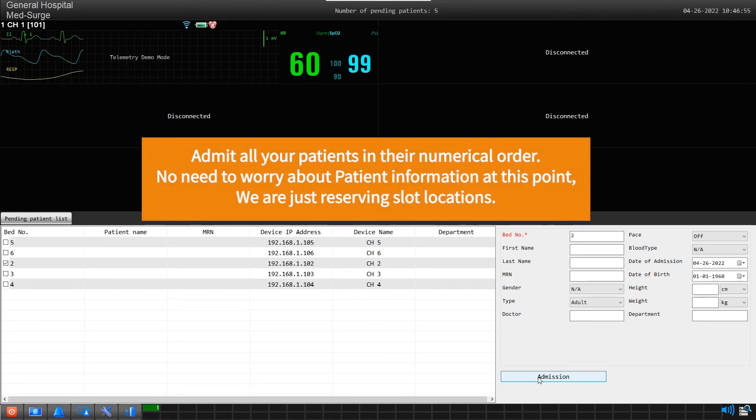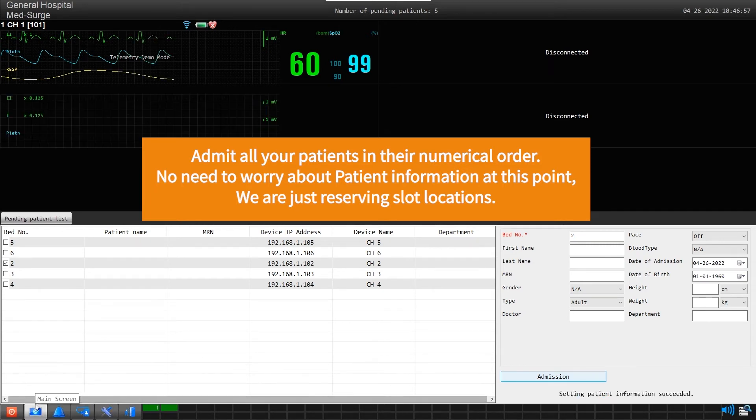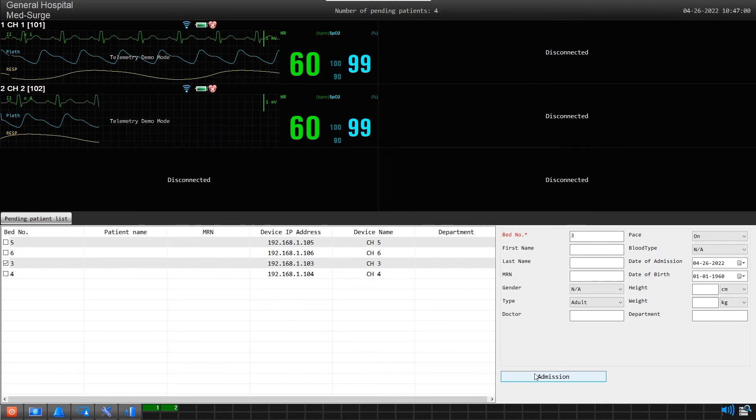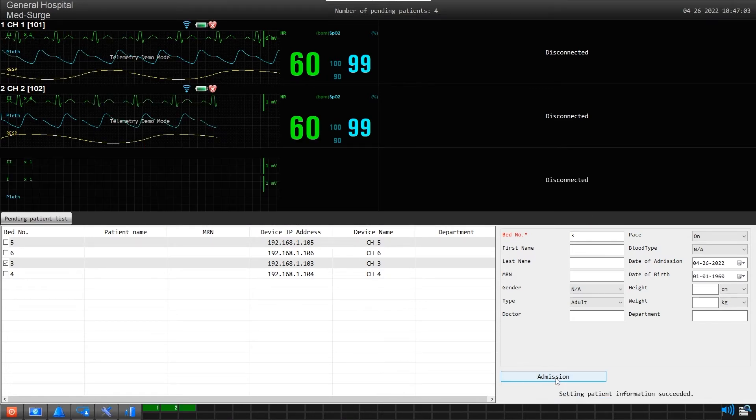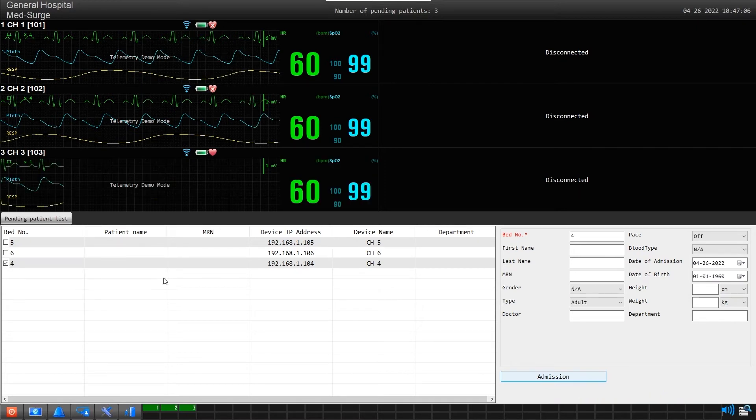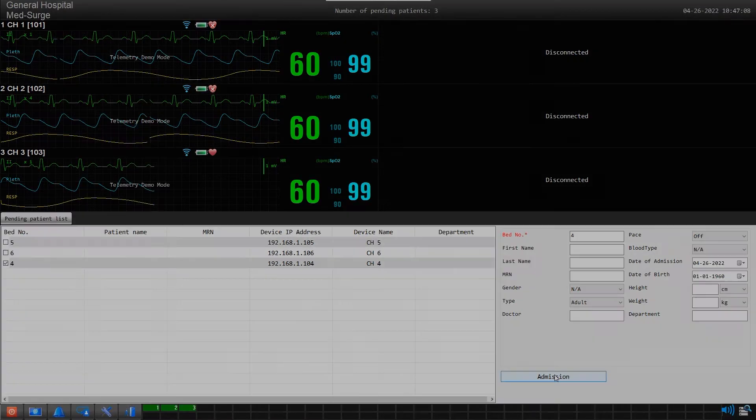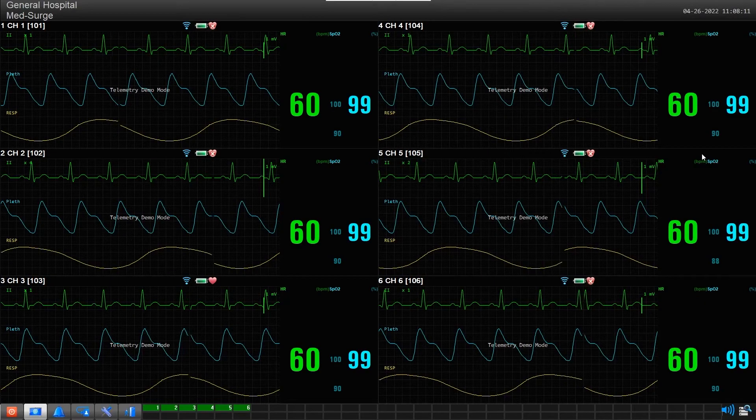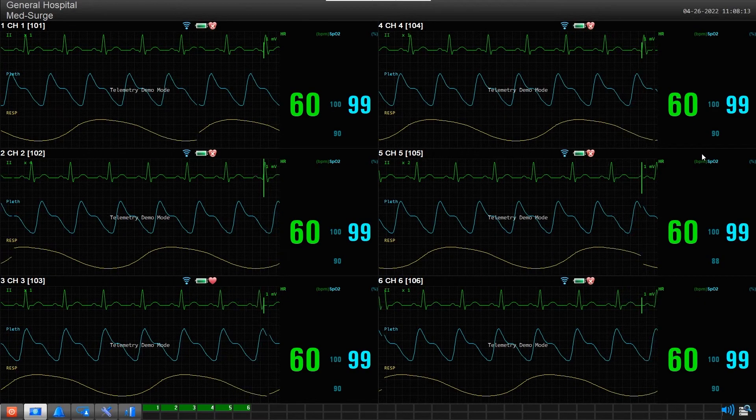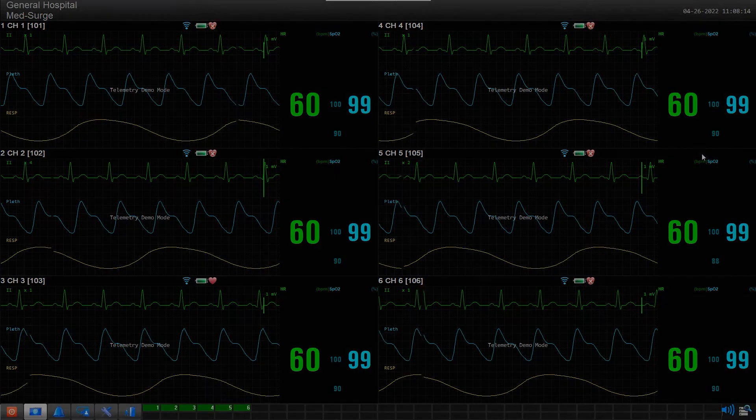There is no need right now to fill out patient information. We are just reserving device locations. Now admit channel 2. You will notice that it will appear in the next available slot right after channel 1. Now continue until all your transmitters have been admitted. When you have finished, all 6 transmitters will be admitted in sequential order.